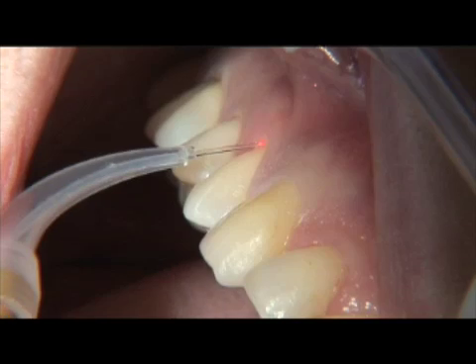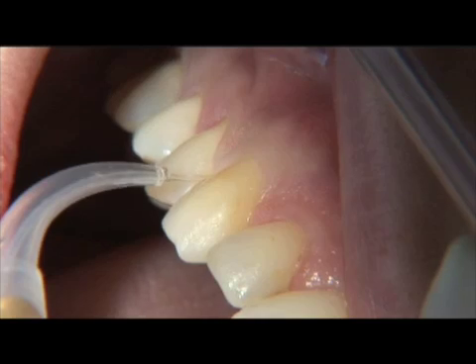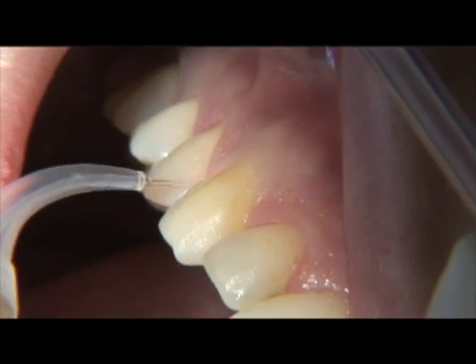The laser sulcular debridement phase is performed in the pulse mode setting, and it is not necessary to initiate the tip of the fiber for sulcular decontamination.